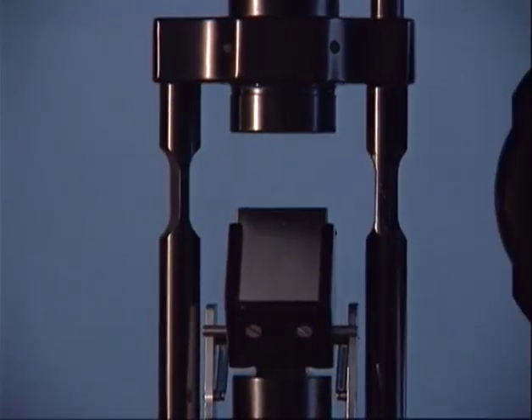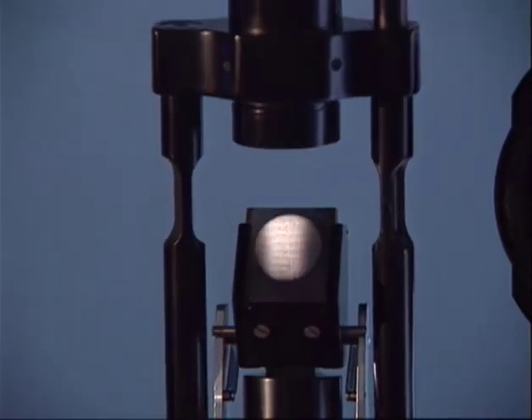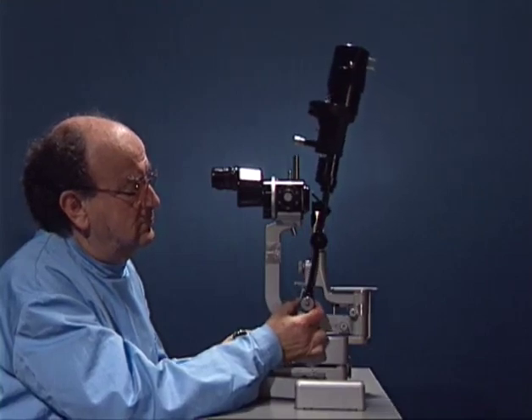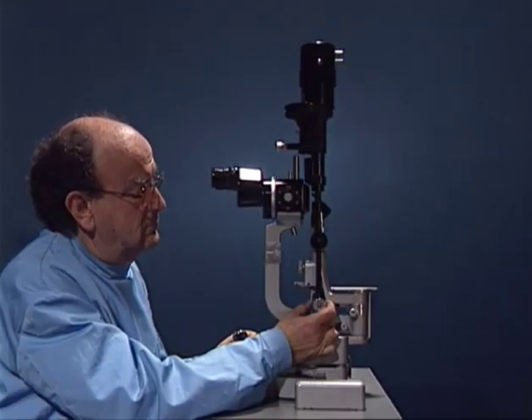However, the small mirror has the disadvantage of catching only a small part of the light beam. For the transmission of the full beam, the illumination unit must be tilted forward by 10 degrees. Tilting the unit affects the quality of the slit light, which is perfect only with an upright unit. Then the beam is perfectly sharp and equally narrow.